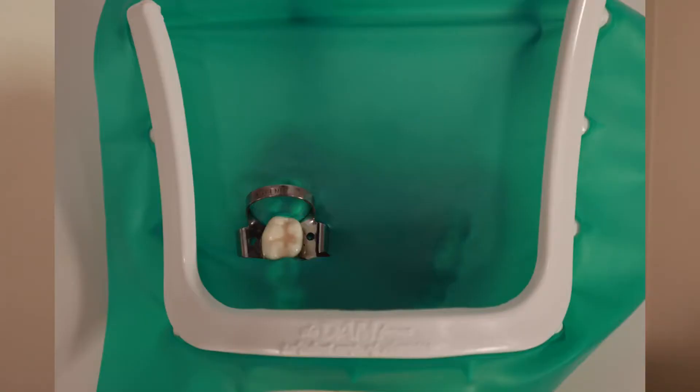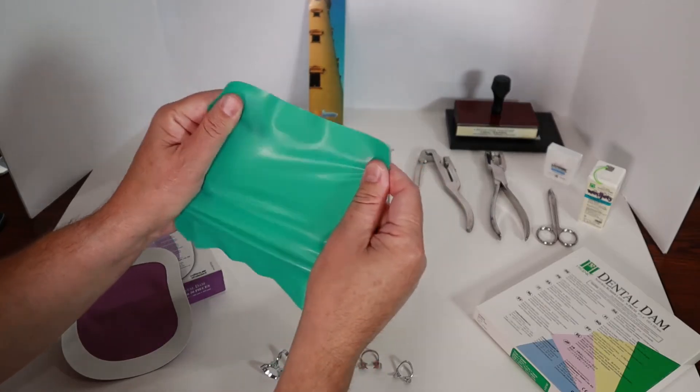So in dentistry, we use rubber dams like a drop cloth for the mouth. The rubber dam gets stretched over a tooth or several teeth and is secured with a clip. It acts like a drop cloth — it keeps your tongue and cheek away from the tooth I'm working on, keeps your spit from getting onto the tooth, and also keeps tooth dust and filling particles from going into your mouth. Here's a closer look at the different rubber dams and the tools I use to install them.